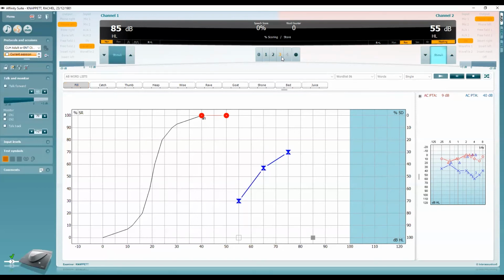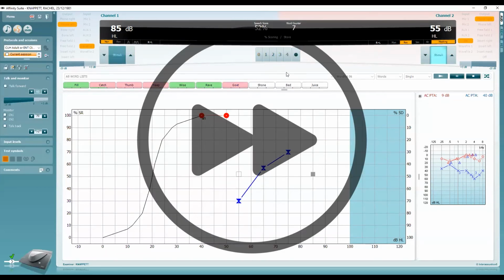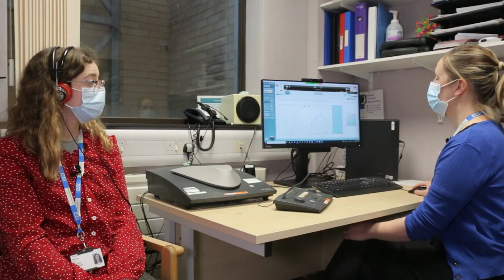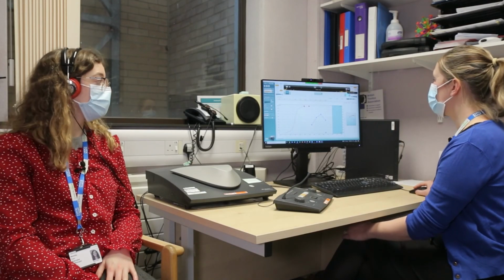Fill. Can't really hear. Bed. Can't really hear. Okay, well done, you did really well.